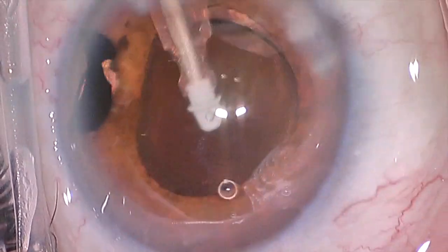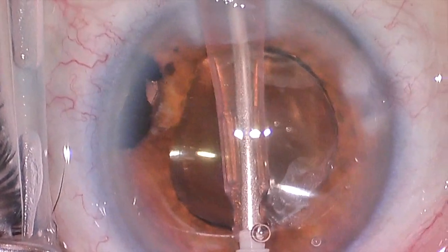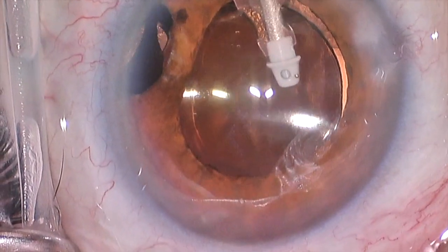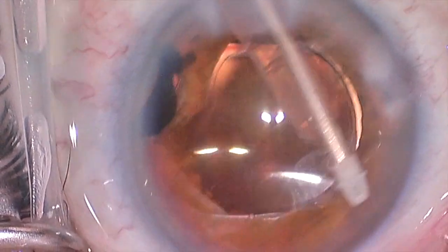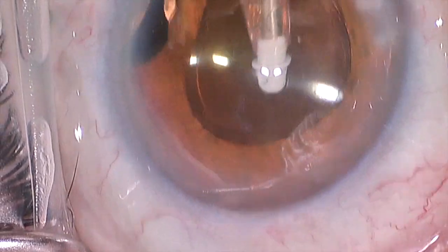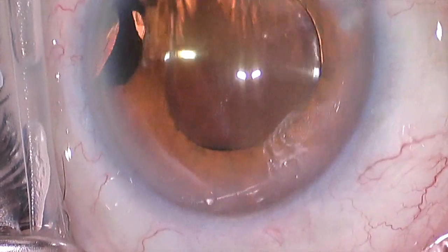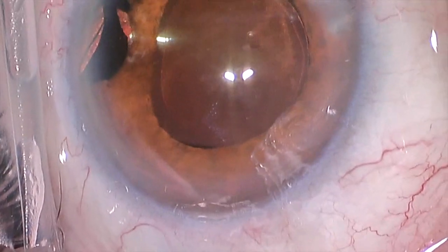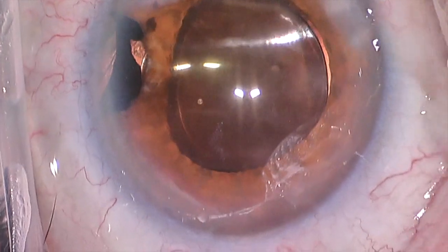Now we're using irrigation aspiration to get all the viscoelastic material out of the eye. That material is helpful during the surgery, but at the conclusion of the case we try and remove it all, because if it remains in the eye it causes the eye pressure to go up substantially. It doesn't flow through the eye very well like the natural aqueous that the eye makes, and it tends to clog the drain of the eye if it remains. So we remove as much as possible, sweeping behind the lens in a 360 degree fashion to get it out of the corners of the eye.